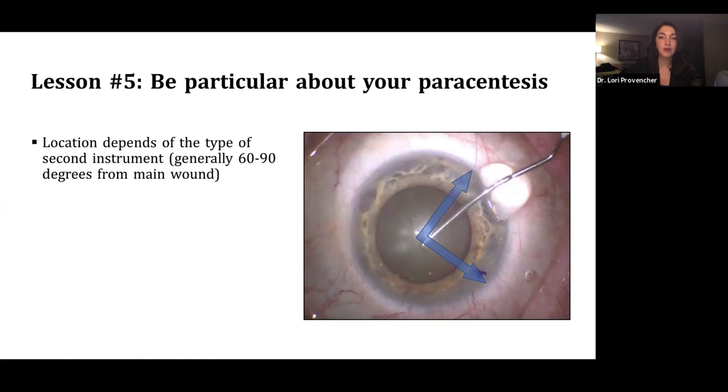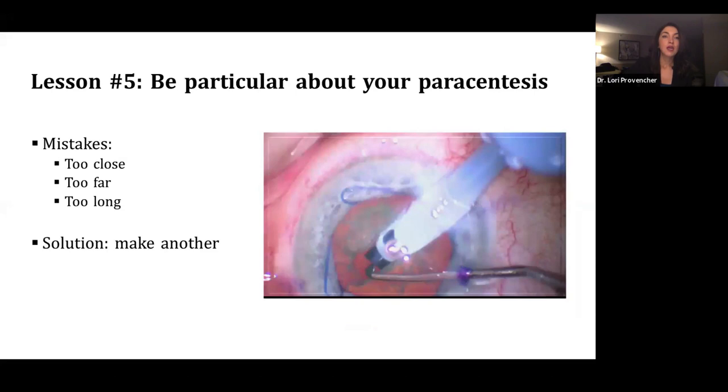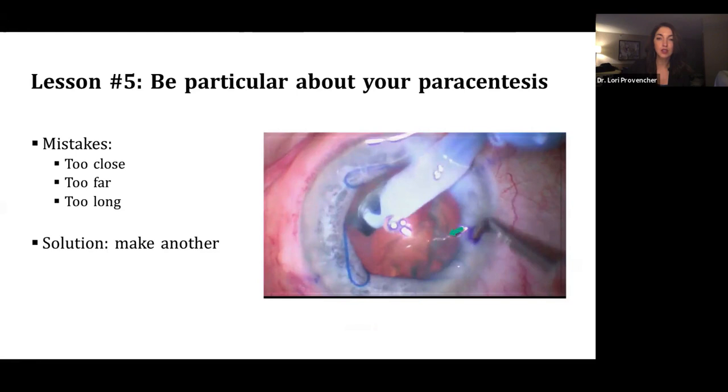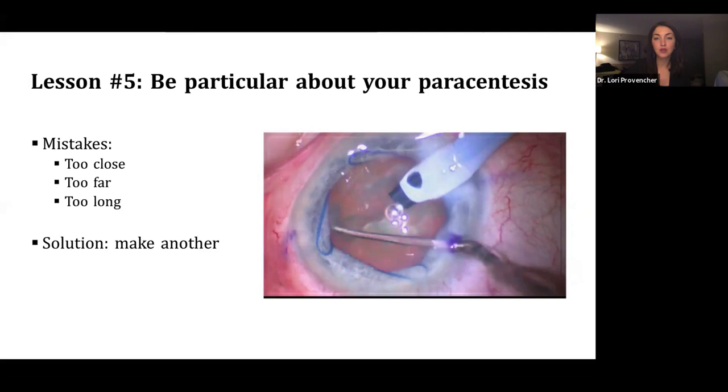So here's an arrow showing 90 degrees. You can see that my para in relation to my main wound here is about 60 degrees. And what I do at the start of the case is I kind of rest my hand where my main wound is going to go. And then I decide, I kind of back-calculate and put my para in relation to that. And so if your para is too close or too far from your main wound, you can run into a lot of funny issues.